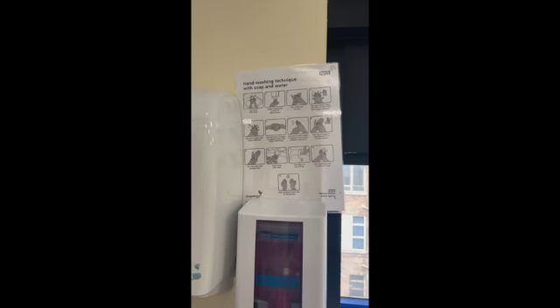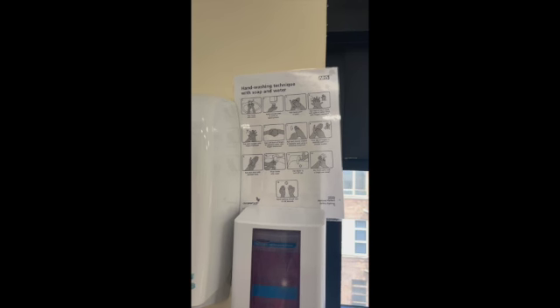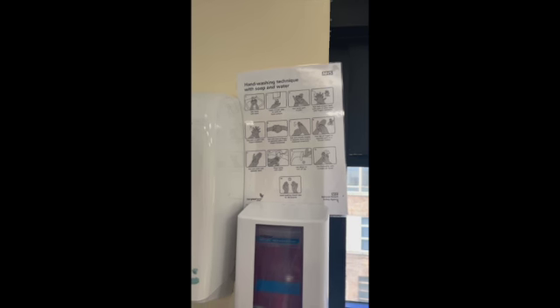The next thing I have to do is wash my hands. Now, before I can wash my hands, I have to make sure that I'm bare below the elbow. So I'll be taking off my watch and my rings. So I'm going to wash my hands following the correct hand washing technique with soap and water. This first hand wash will be a social wash, so I'll only be washing my hands once.